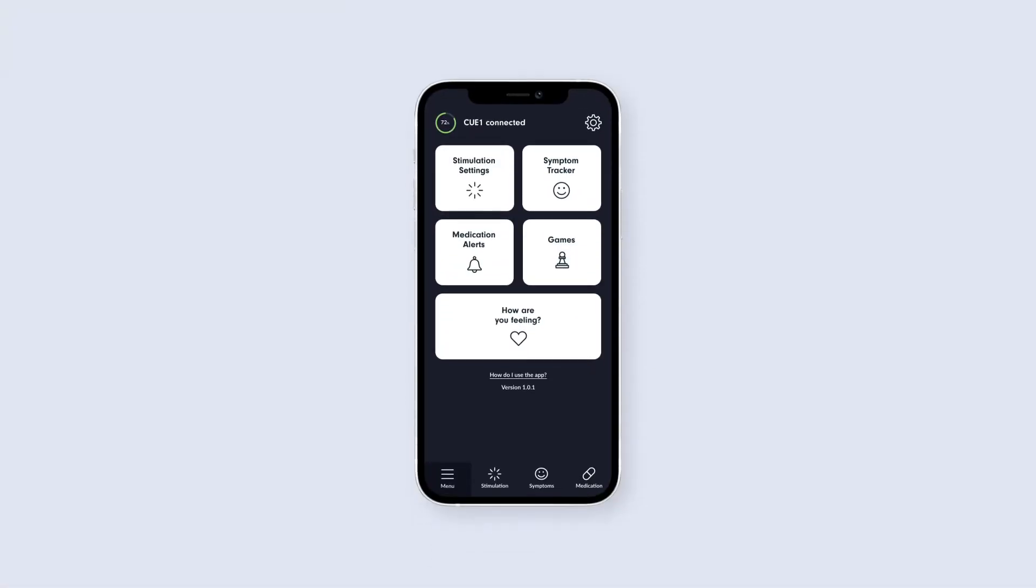At the top of the app's home screen, you should be able to see the CUE1 connected sign, along with the battery indicator showing the CUE1's current battery level when connected. If your CUE1 is not currently connected to the app, you will see a screen like this.